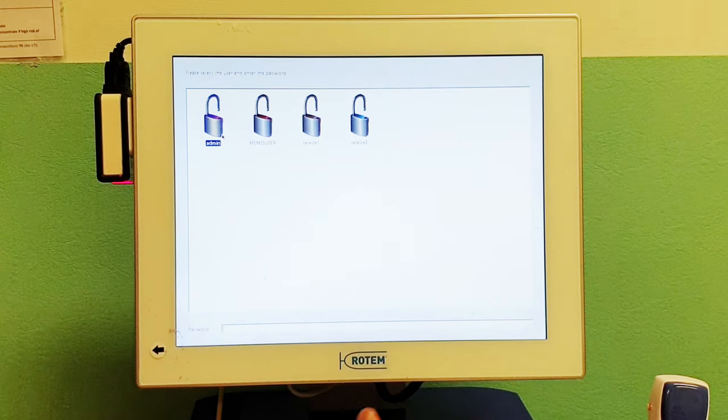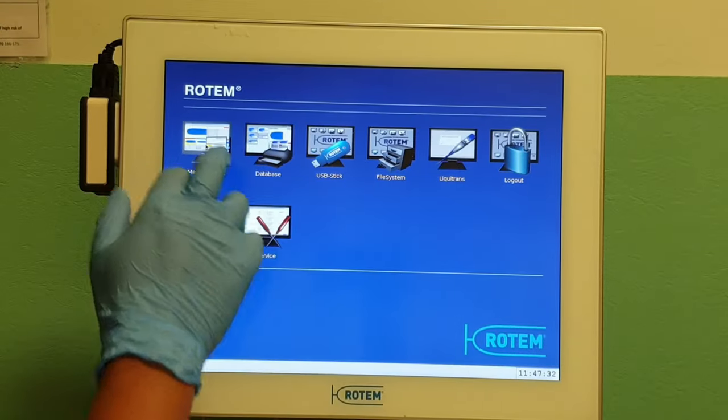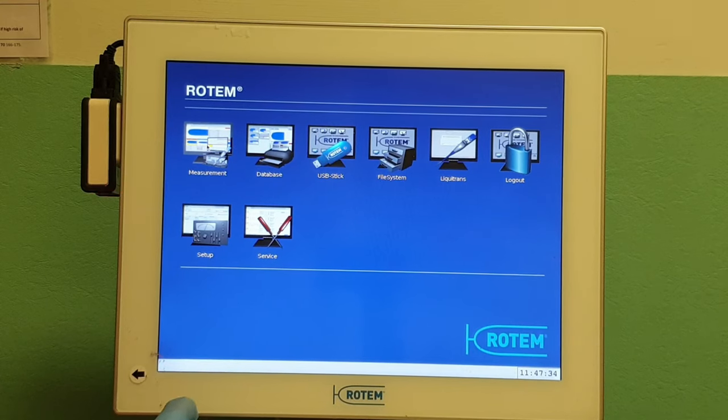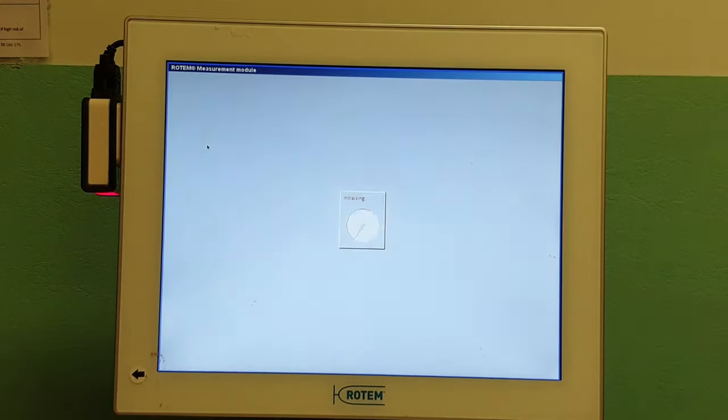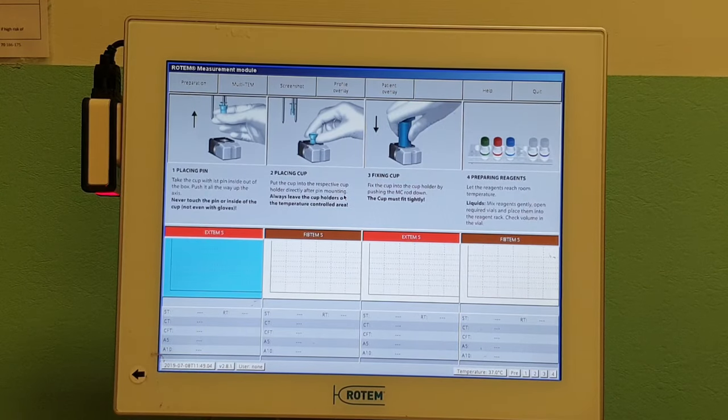In order to switch on the ROTEM machine, it may start up in one of two screens. The first one will have the admin button and the password is 'admin' all lowercase, and then you will get the patient overlay screen. The other screen that may come up is a blue screen, and what you want to do is double click on the measurement icon — just to warn you, it may take some time for it to load up — but it should then come up with the relevant patient overlay screen.